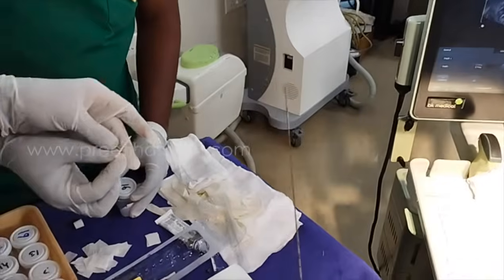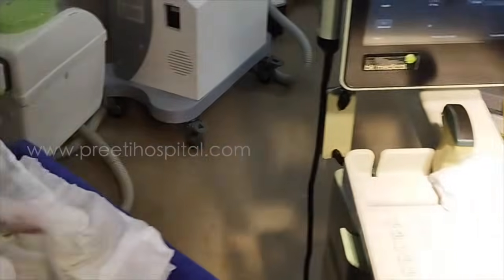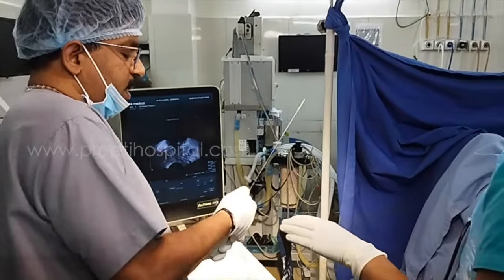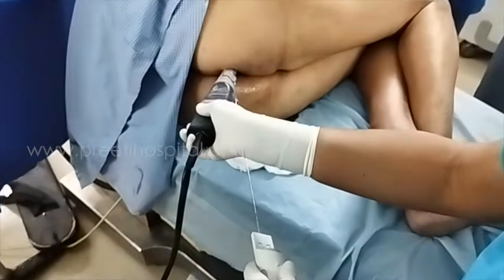This is left side axial, middle of the base, middle part of the gland. Now we will go to one more biopsy in the same region. Two biopsies we have to take. Not here, we have to change.